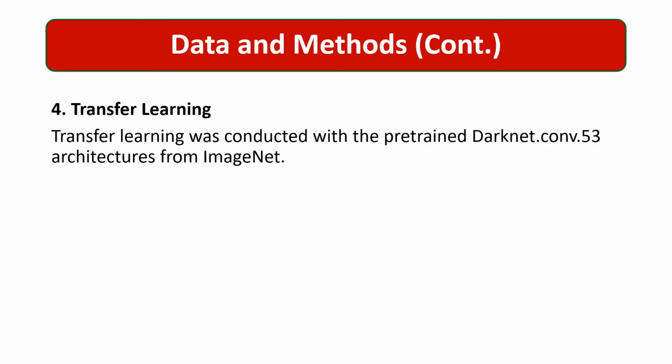The last method is transfer learning. Transfer learning was conducted with the pre-trained Darknet-53 architecture from ImageNet. The transfer learning retains initial pre-trained model weights and extracts image features through a final network layer.